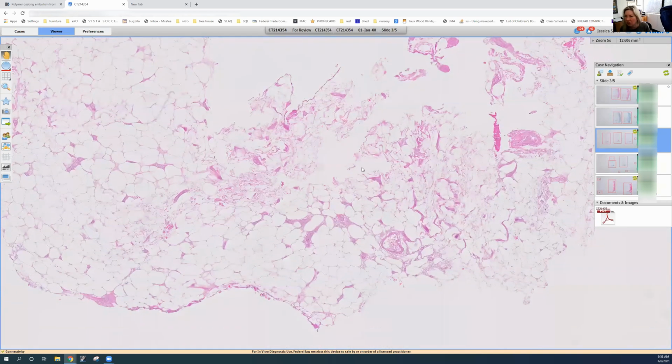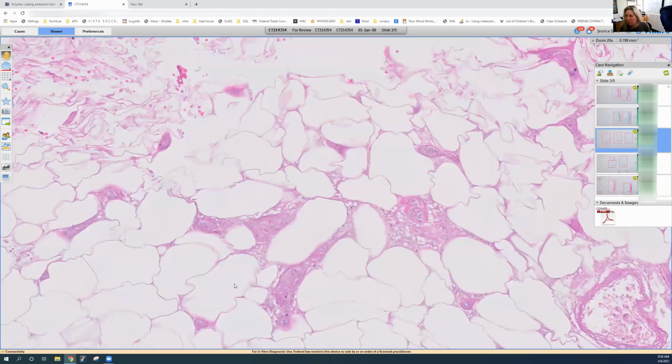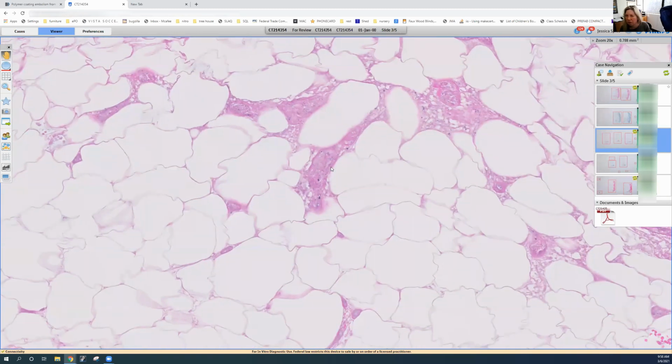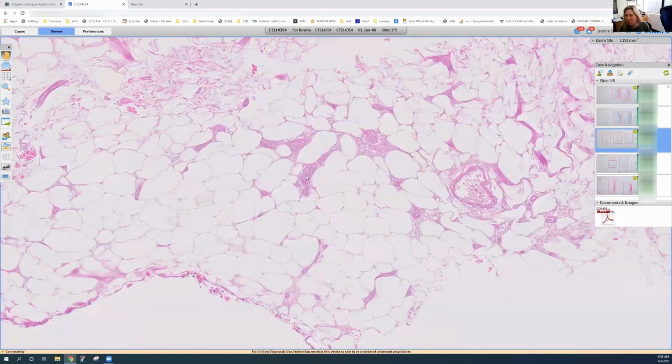in this patient. You can see actually this is subcutis and it has a very pink appearance. This is ischemic necrosis. And here are vessels that are dying. And I think these are fibrin thrombi. And there may even be some calcification in here. So this is a really beautiful example of calciphylaxis.